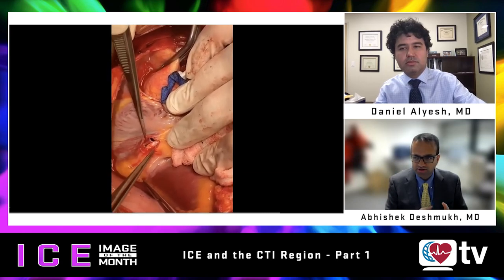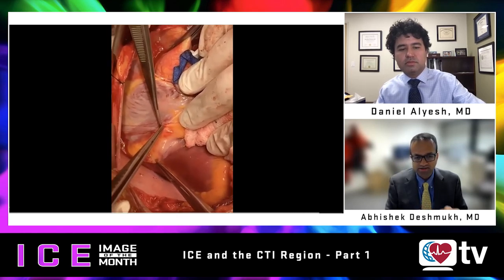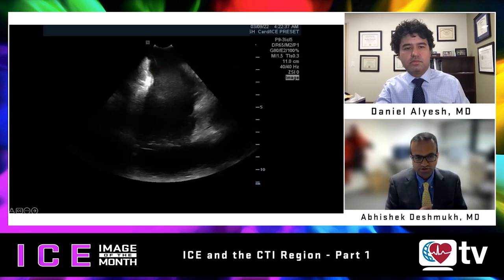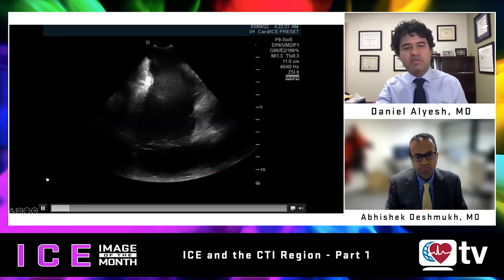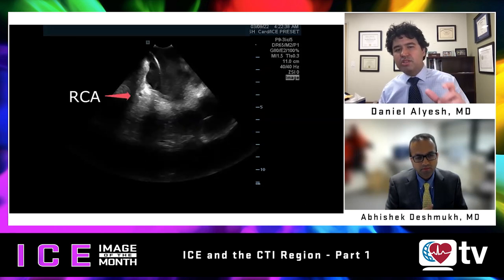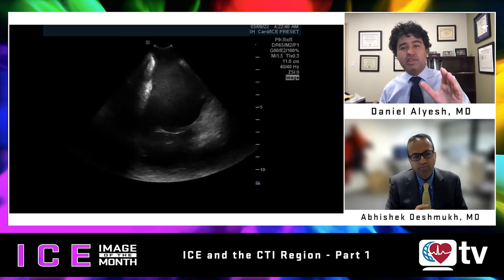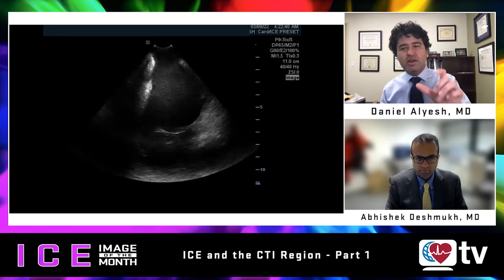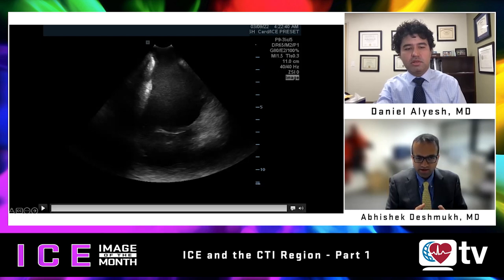Sometimes when we see the right coronary artery on ICE we wonder why we are not creating more inferior wall MIs while doing CTI flutter lines. With good flow in the right coronary artery, there is a heat sink effect which can shunt away convective heating that happens during radiofrequency energy — a fail-safe mechanism for protection of the RCA, though not always reliable. You can see the course of the right coronary artery in the home view, then gradually counter-clock the catheter to look at the lateral portion of the CTI without the RCA nearby, allowing a safer approach. As you go more lateral, the right coronary artery moves away, but it is closer when ablating more septally on the annulus.